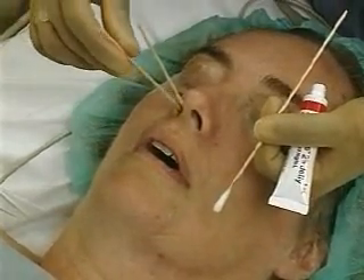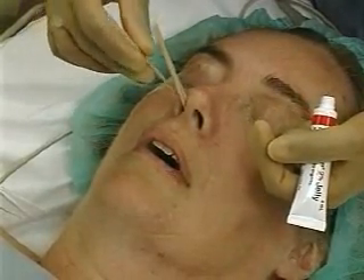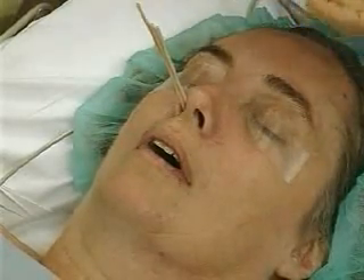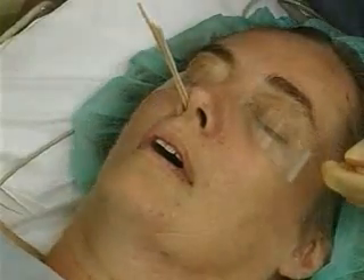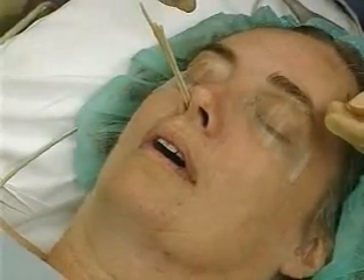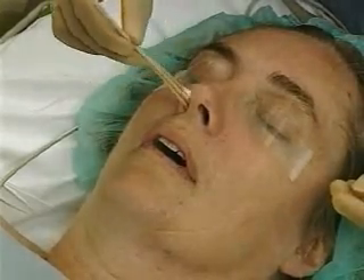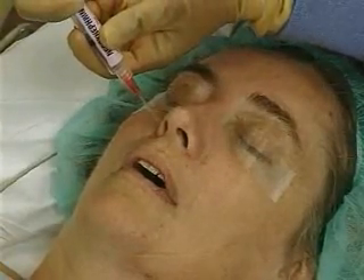Gently place successive swabs deeper into the nares until three swabs can comfortably be placed simultaneously to the level of the posterior nasal wall. If three cotton swabs can be accommodated, then a 7.5 millimeter airway will pass. If swabs are not available, the lidocaine slurry can be applied via a syringe directly into the nose.